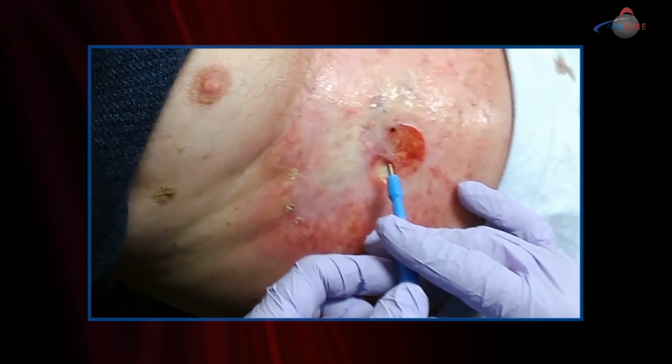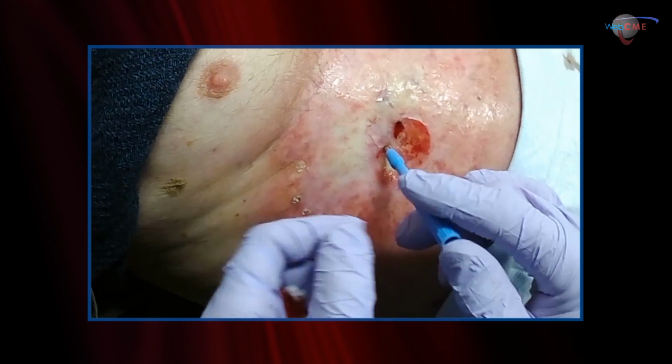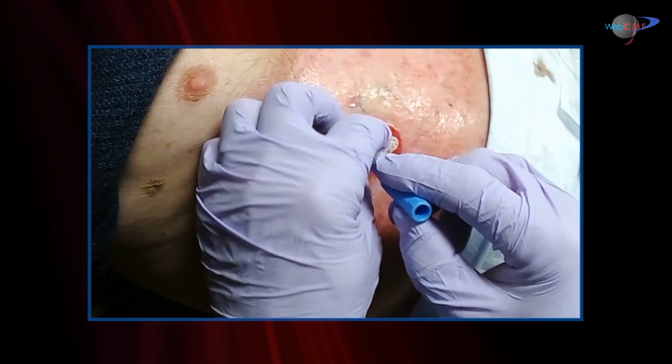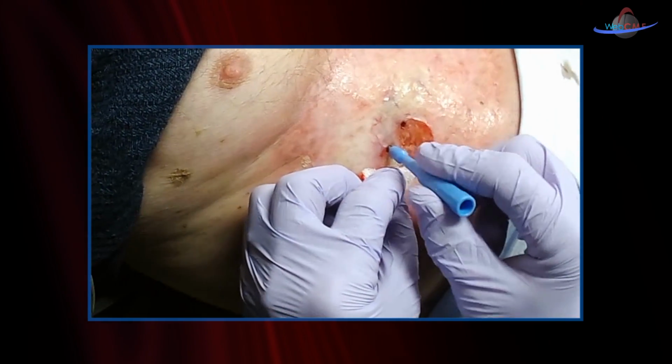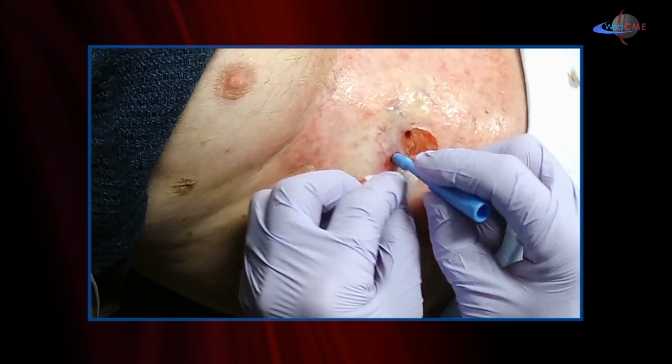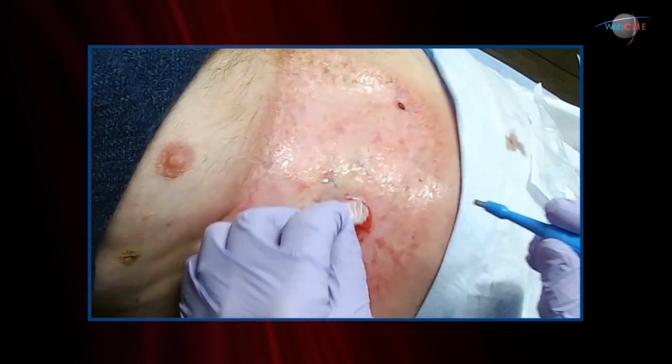And again, I'm going to straddle the area that I want to biopsy. The biopsy probe is rotated. Gentle pressure inward until it reaches the hub, as you can see there. And then we pull out.